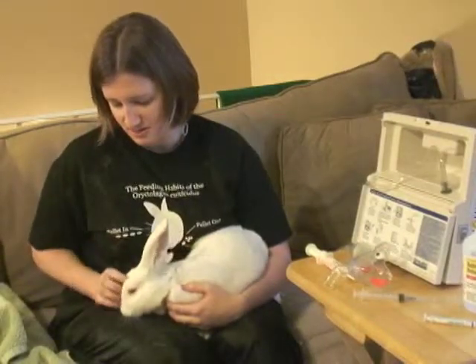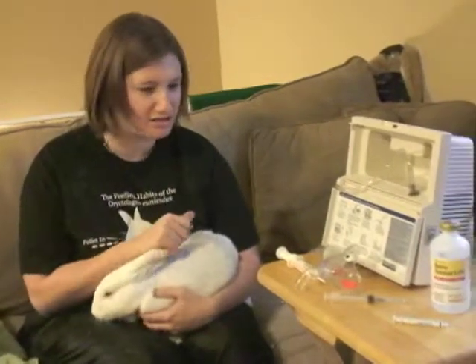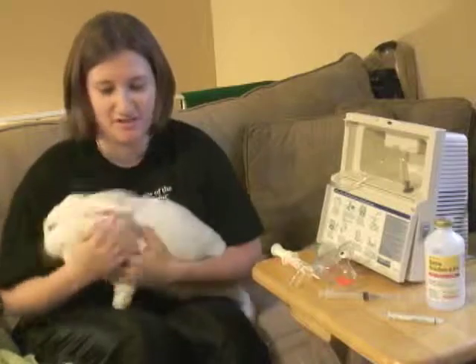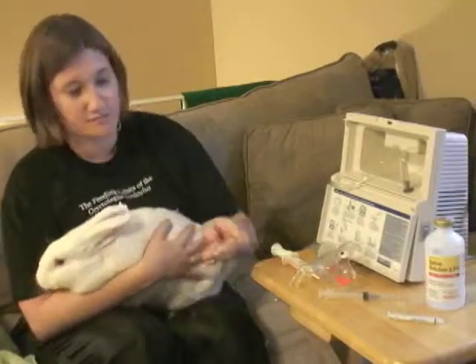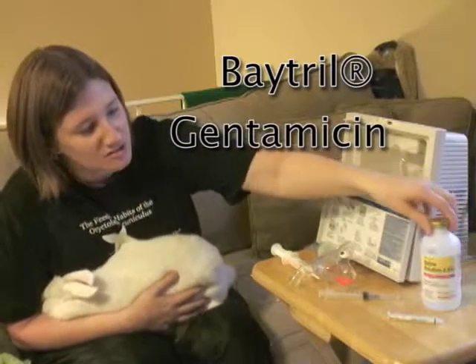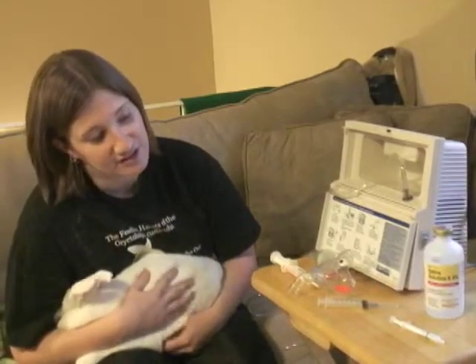She had a culture and sensitivity test and that came back positive for Pasteurella. The medicines that were most effective were the Baytril and the Gentamicin, which is in this saline here. Twice a day we do 1.5 milliliters.